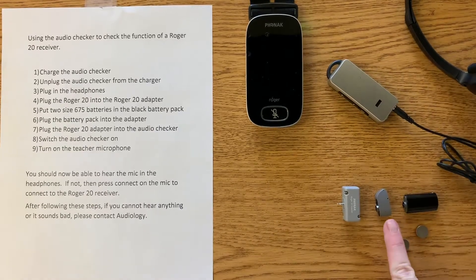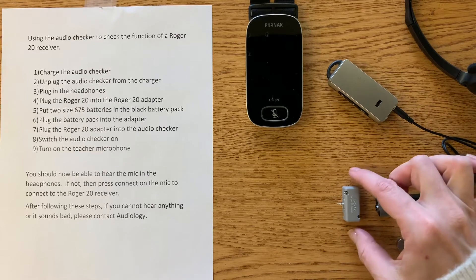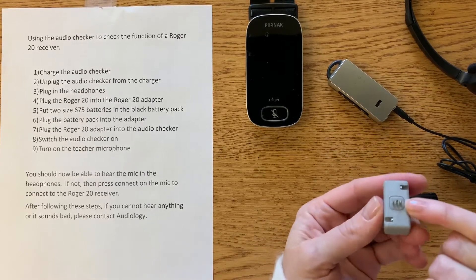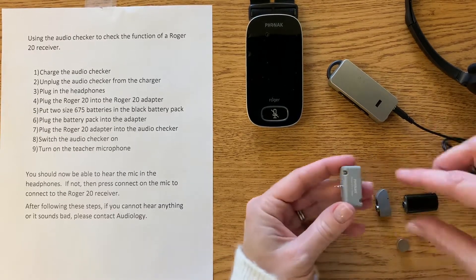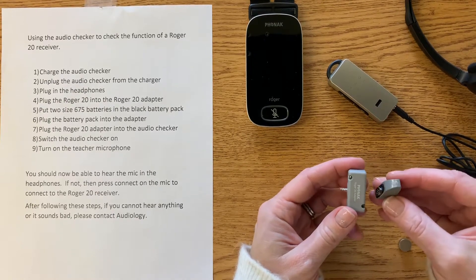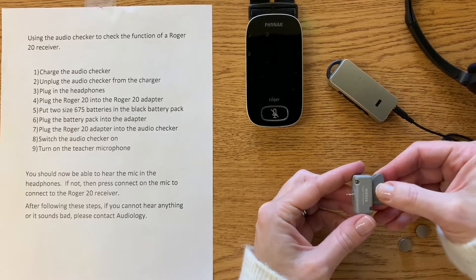Next, we need to plug in the Roger 20 to the Roger 20 adapter. If you look closely at the adapter, there are three posts and one of them is a little bit larger than the other two. Have that post on top and facing to the left, then pick up the Roger 20, line it up, and twist it forward slightly until it's snug.